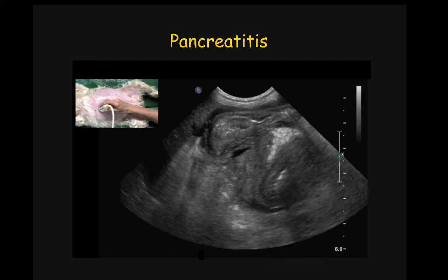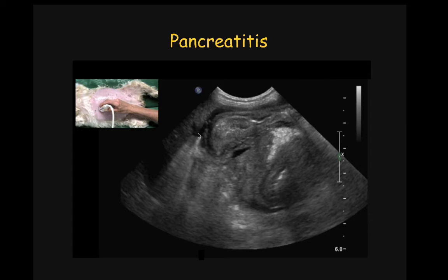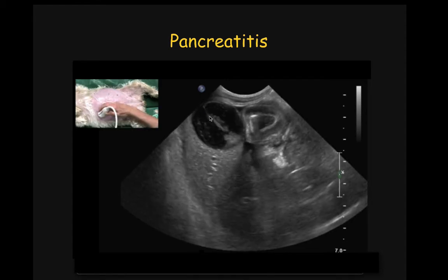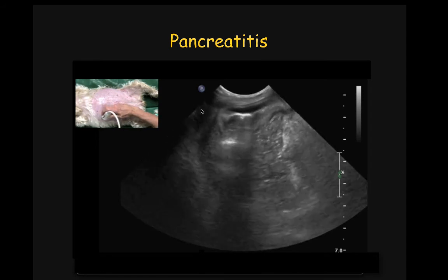Now reviewing a video clip of a dog with pancreatitis. In the insert you can see the probe motion. This pancreatitis affects most of the pancreas — left limb, body, and right limb regions. Notice the position of the marker on the probe; in this case it's towards the head of the dog. On this still image, we see part of the liver, a small amount of anechoic fluid, thickened GI wall near the enlarged and hypoechoic pancreas surrounded by hyperechoic fat. On real-time, here is the gallbladder containing a moderate amount of echogenic sludge.